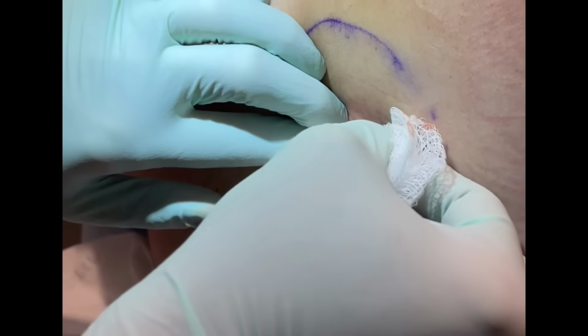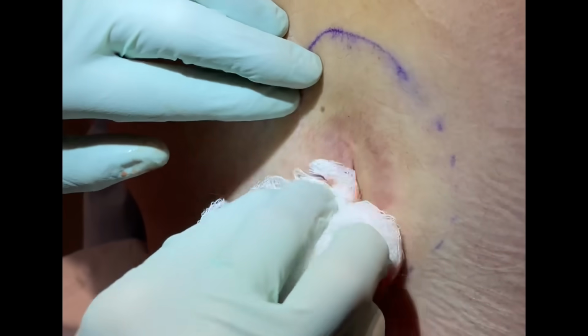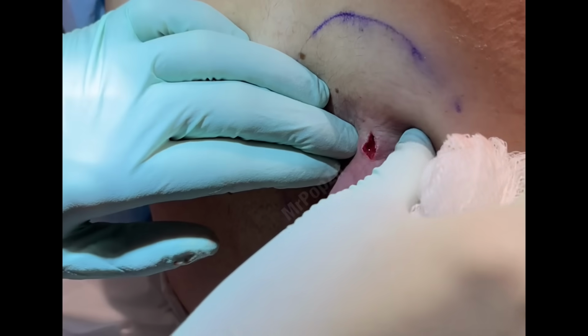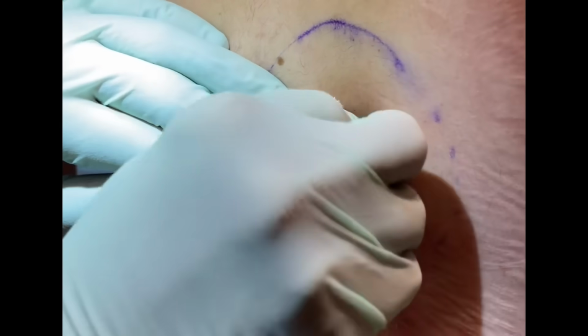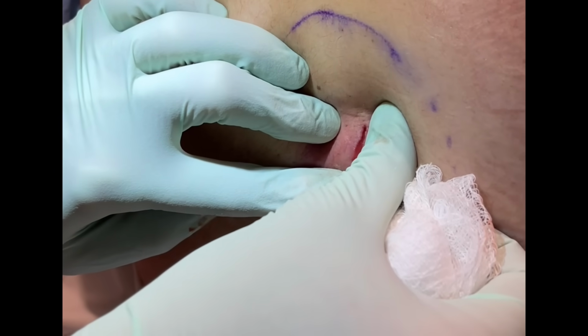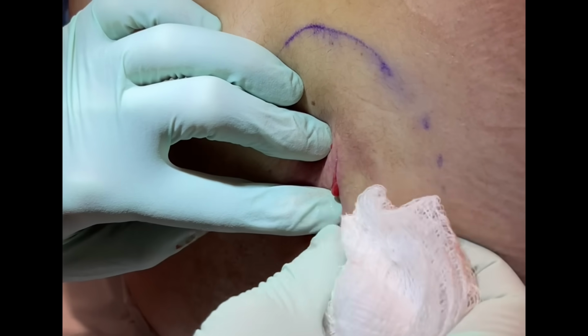And I'm going to see you kind of quick, though, because of your ability to make a lot of fluid here. Maybe I'll see you in 1 week, and then each week for the next 2 to 3 weeks until we get that to close. But that's all the fluid in there. I don't see any others. And she's not real tender underneath either. So that's good.